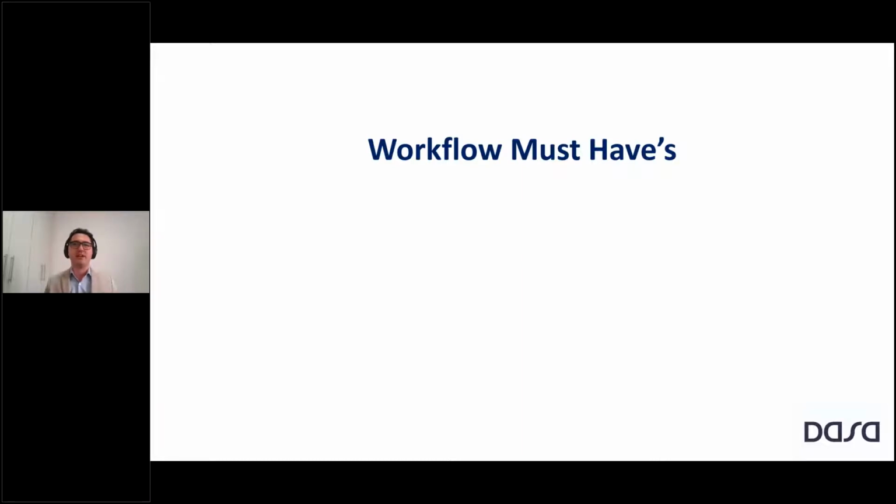So this is something we have to keep in mind when we're using these kinds of integrations that prioritize studies. I have listed here the must-haves in terms of AI workflow, at least in my opinion. I'm not saying I am telling the whole truth here. Maybe you have a different experience in deploying AI in your institution, but what I found useful is: AI must be easy to use. It must be transparent. I must see the result, and the result must be clear. It also must be timely. I must see the result exactly at the time I need that information. So timely is also important here.